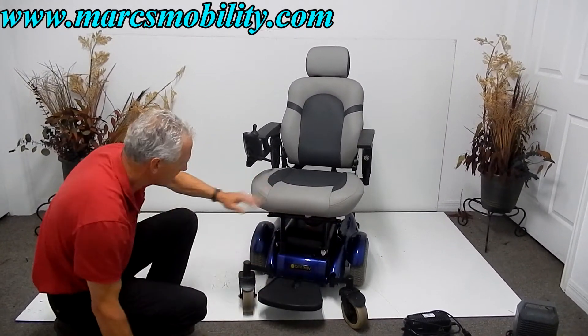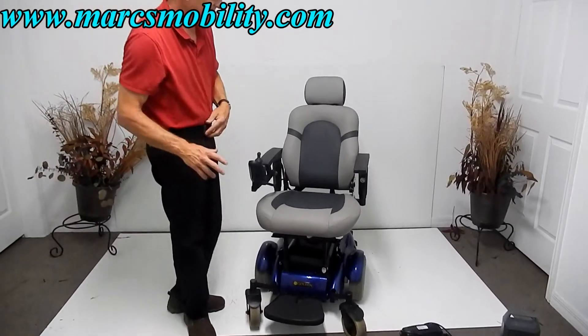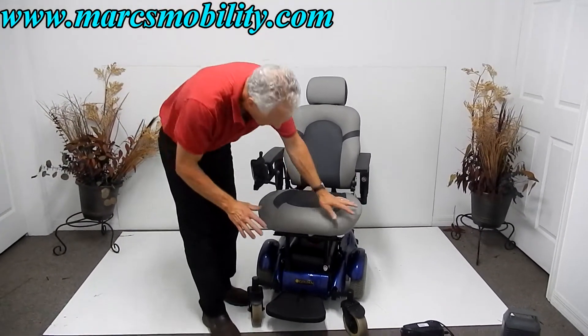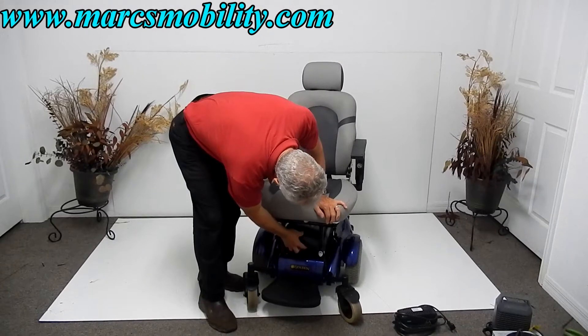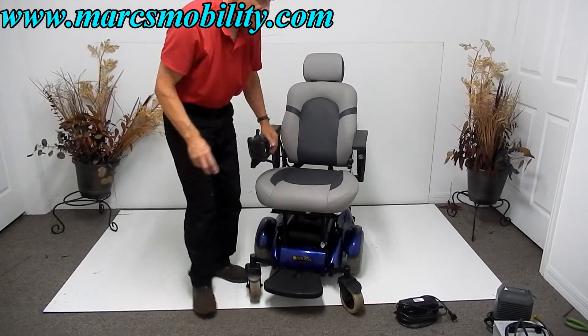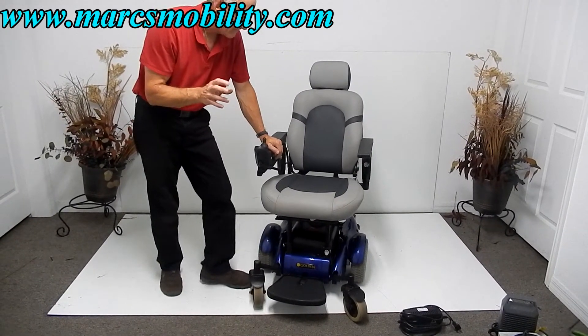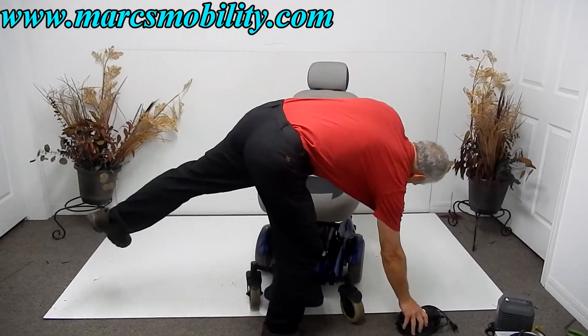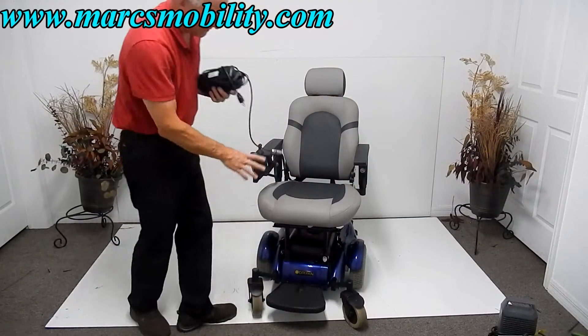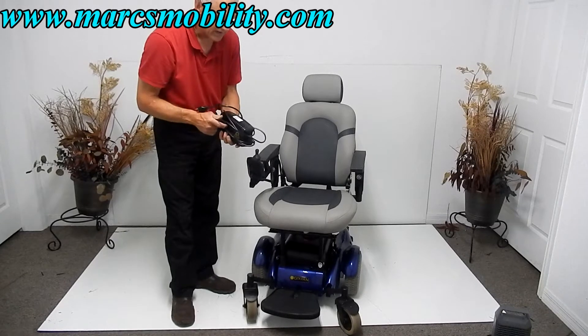This chair has a 300-pound maximum weight capacity. The foot plate flips up for easy access, so there's technically nothing in front of you when you get out. The chair takes two batteries and will go about 15 miles on a charge. You have to take the seat off and pull up the cover — the two batteries are back-to-back under the seat. You want 35-amp batteries.